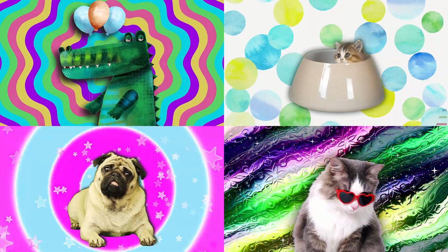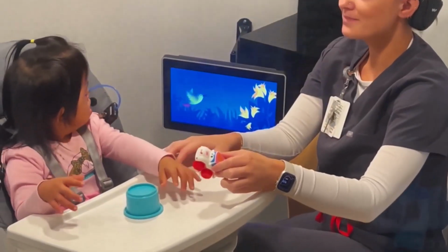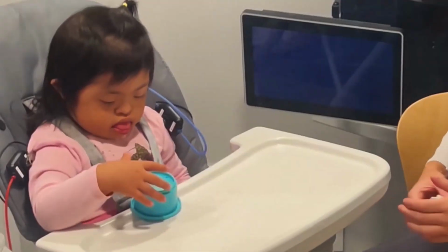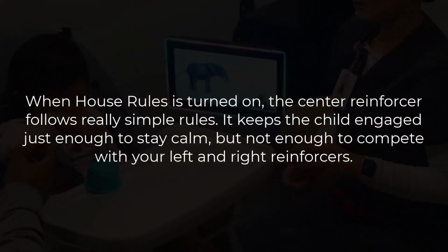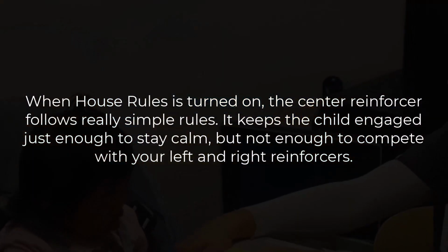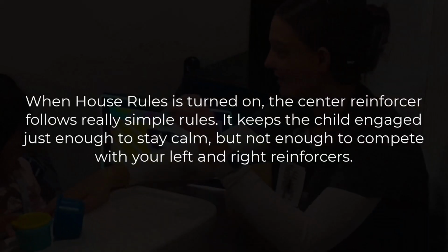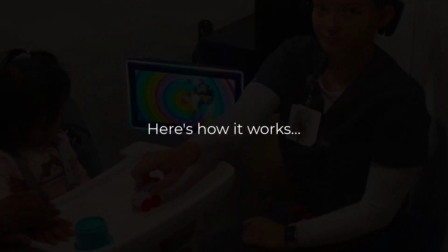When the center screen grabs the child's attention, they actually kind of fixate on it, and it becomes harder to get those consistent head turns to the left and to the right. So house rules helps to fix that. When house rules is turned on, the center reinforcer follows really simple rules. It keeps the child engaged just enough to stay calm, but not enough to compete with your left and right reinforcers. So here's how it works.